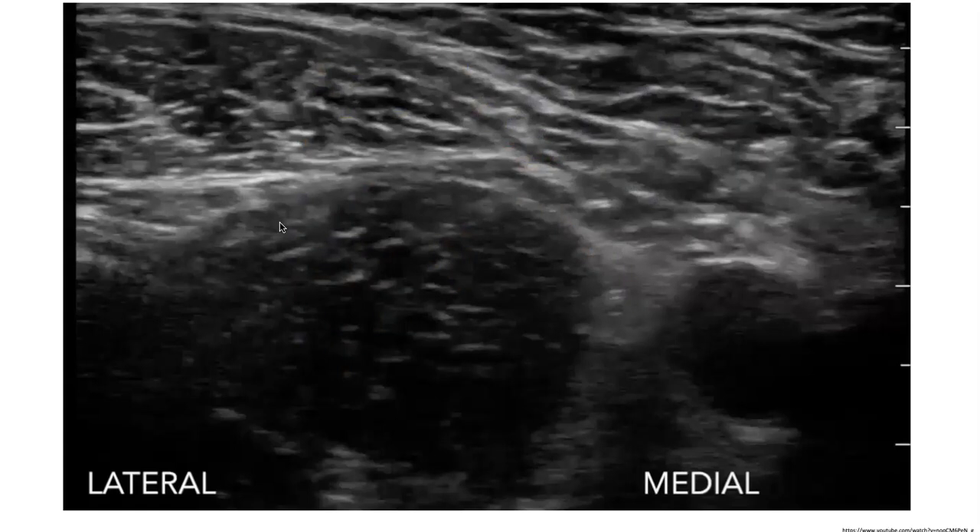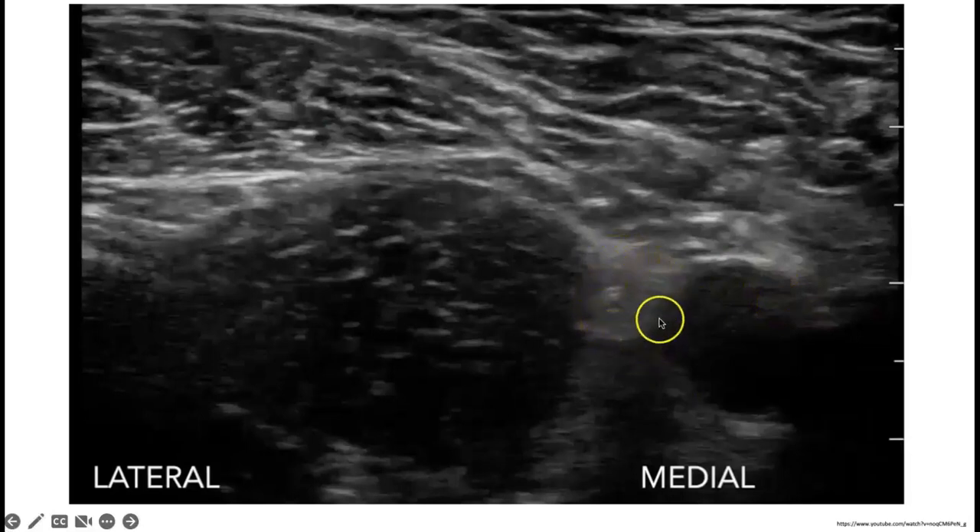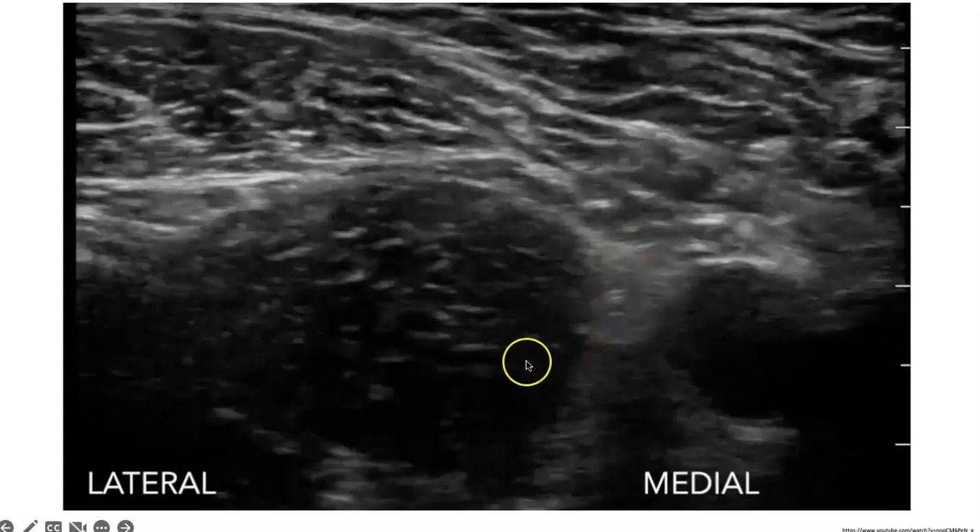This photo shows the ultrasound image generated when the probe is in that location. Lateral and medial are labeled on screen. Here we can see the femoral artery, and the femoral nerve appears as a hyperechoic circle just next to it. Our two major muscular landmarks are the iliacus muscle and the sartorius muscle with that pointed shape. The fascia lata is superficial to the sartorius, and the fascia iliaca sits between the sartorius and iliacus muscles.